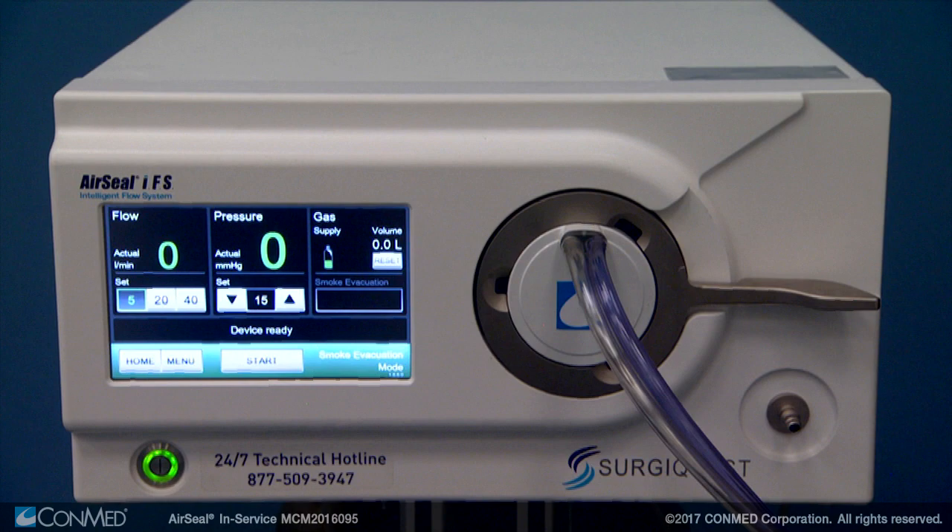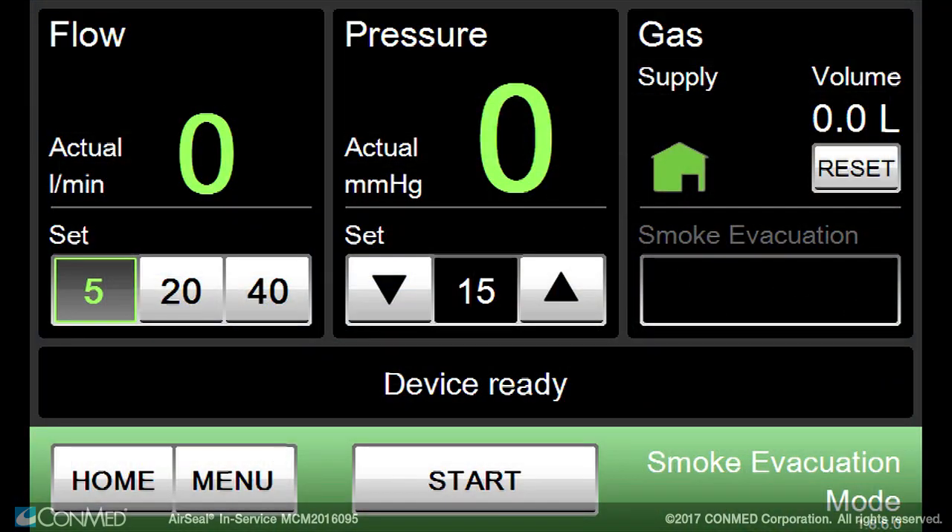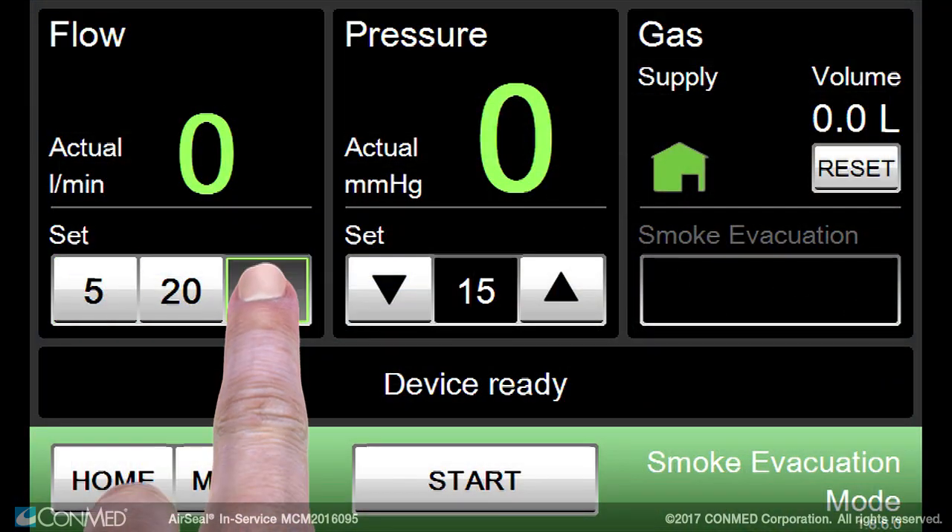The IFS will automatically detect the corresponding tube set and launch into smoke evacuation mode. Set the desired flow rate and pressure values.